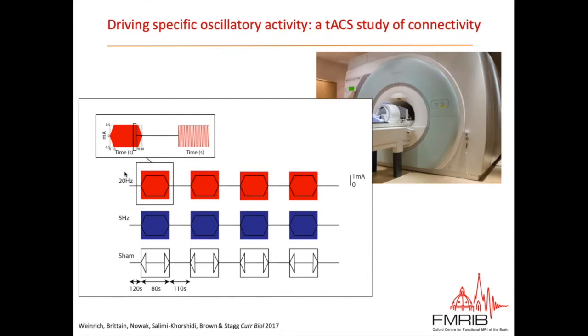looking at how those connectivity patterns changed with either 20 hertz stimulation, 5 hertz, which we were using possibly slightly naively, but we were using as an active control to look if there were frequency specific effects rather than just tACS effects, and a sham condition as a true control.